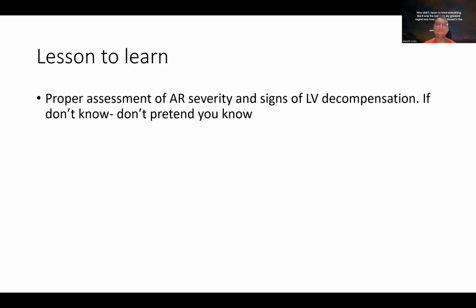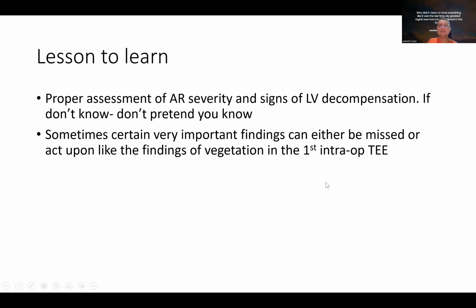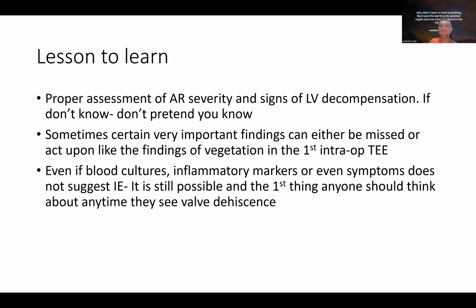None of us know every single thing. Especially to those who go into private practice, then you practice alone. And when you practice alone, if you don't know, please ask or refer to someone who knows. I also do the same. Sometimes certain very important findings can either be missed or not acted upon, like the findings of vegetation in this case in the first intra-op TEE.